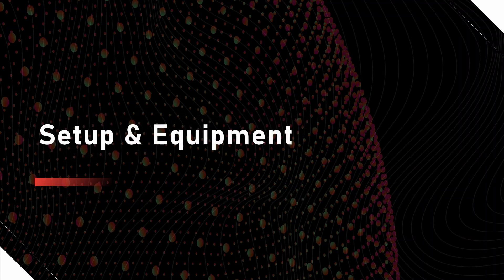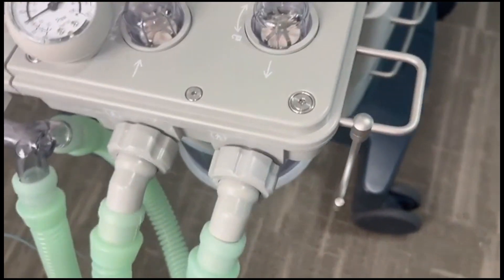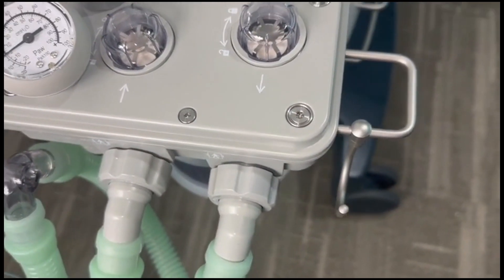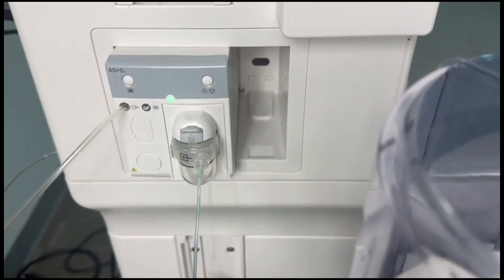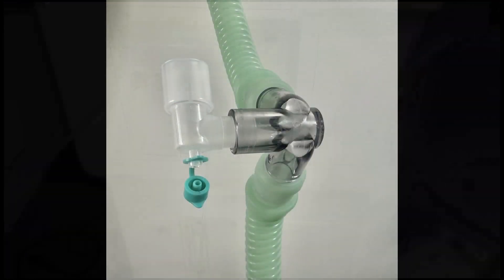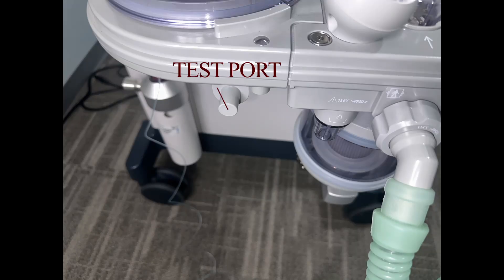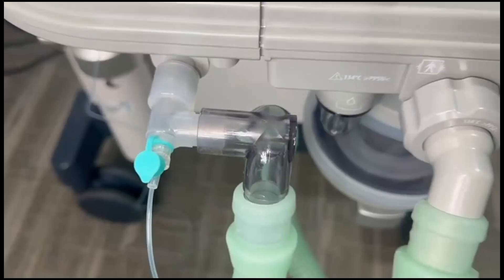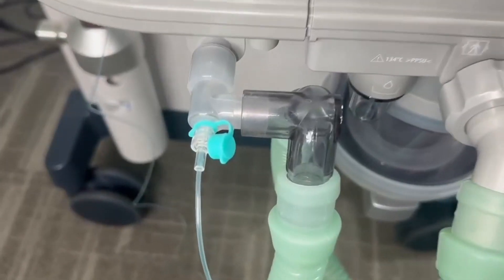Setup and equipment. Connect the breathing circuit to the breathing system. For units with a gas module installed, plug the airway adapter into the Y piece of the breathing circuit, then plug the airway adapter to the test port. Make sure the sample line is connected from the gas module to the airway adapter.